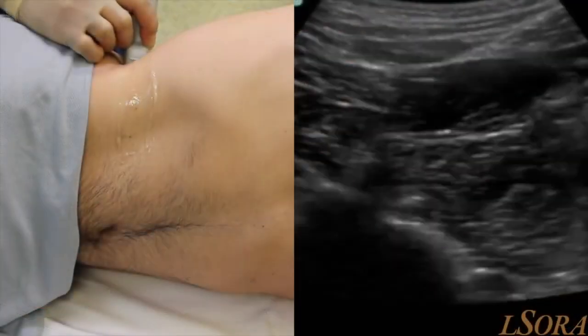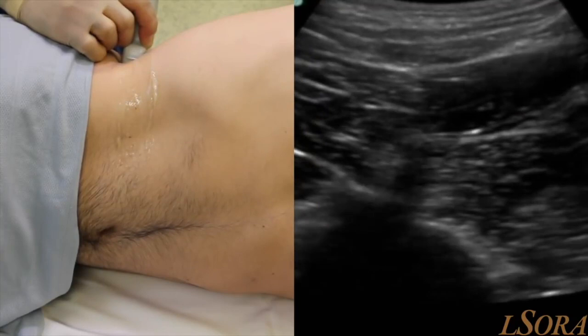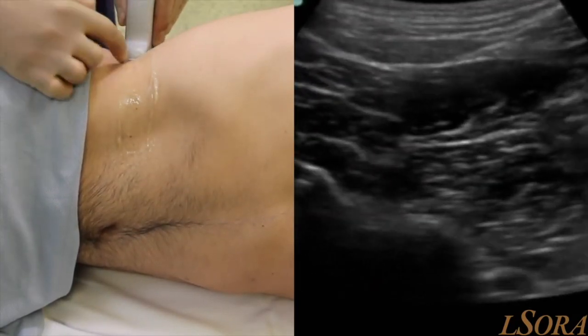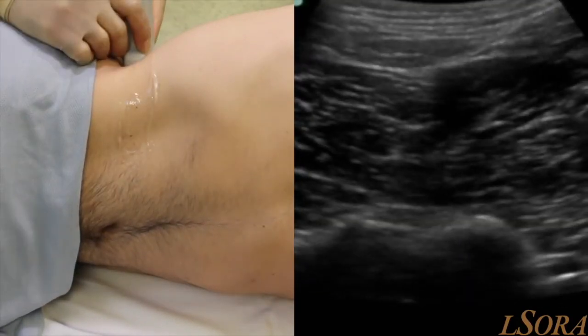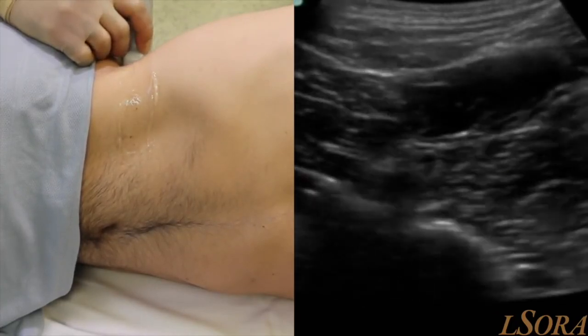With the probe held firmly in place here, we can indicate the potential needle paths coming from either an anterior aspect from the abdominal wall side, and you can see its relationship to quadratus lumborum, or a posterior aspect for a transmuscular quadratus lumborum approach.